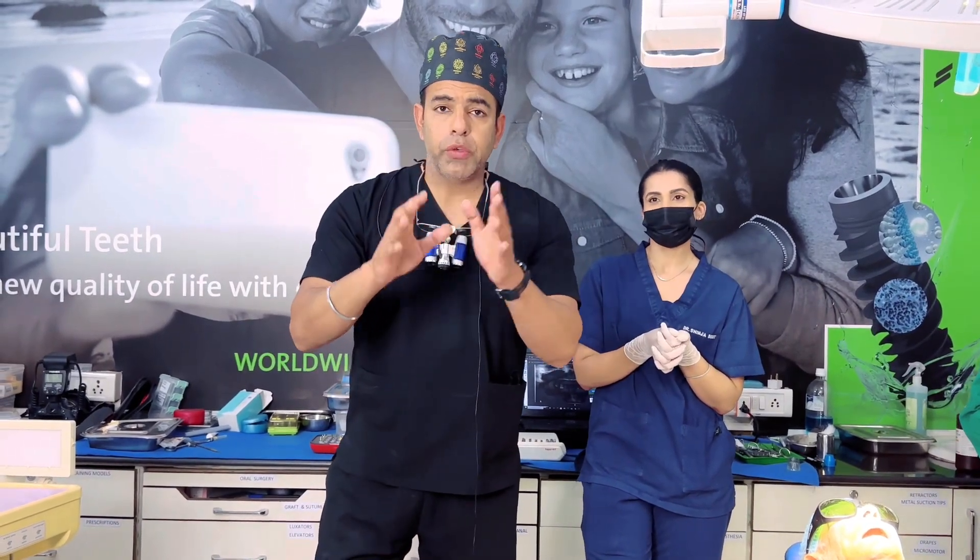I have always said that there is no age limit for dental implants — whether it is 96 years, 100 years, or 18 years. Dental implants are for all. The goal of making this video is to show how to simplify it.